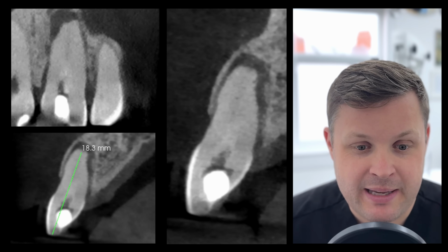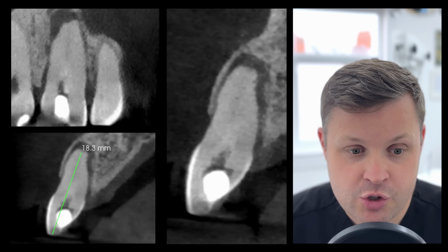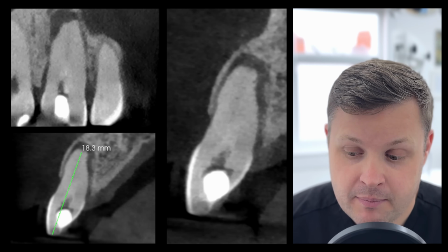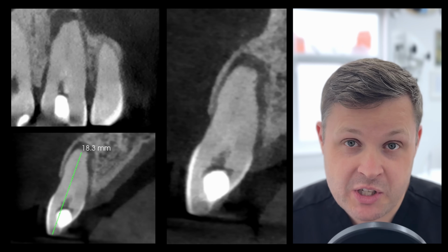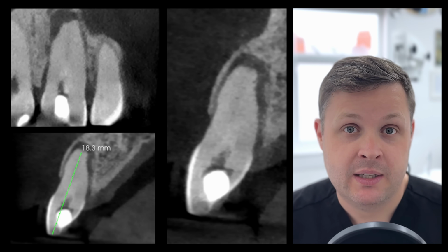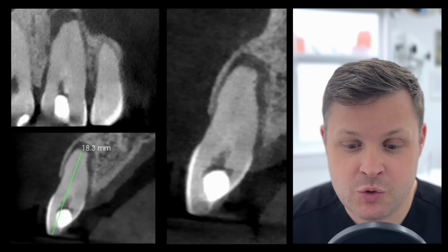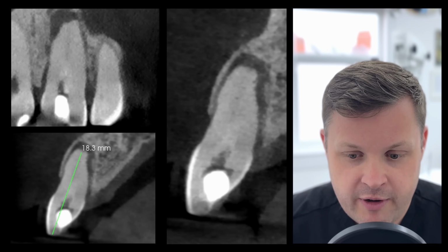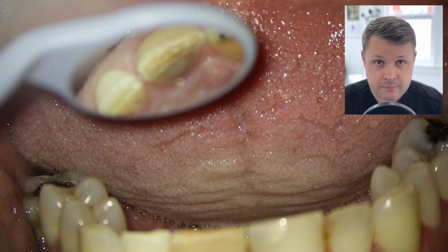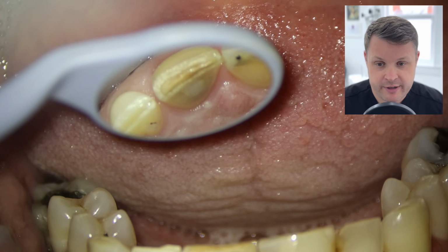So this gives us an indication, when we come to access the tooth, of how far to go down, and if we take a working length measurement, we'd expect it to be about 18 millimeters, which is a very, very important point. What we'll come to is how I worked out that the tooth was perforated. So we'll move over to the video here, and I'm just checking the orientation.